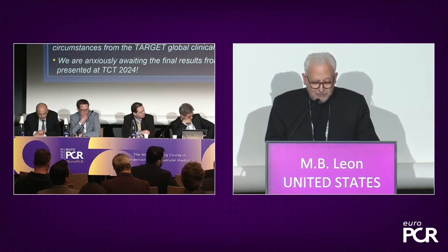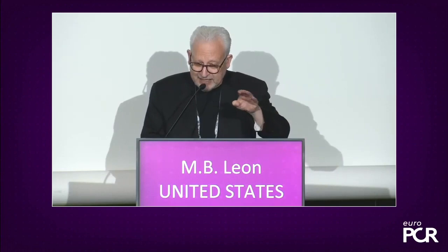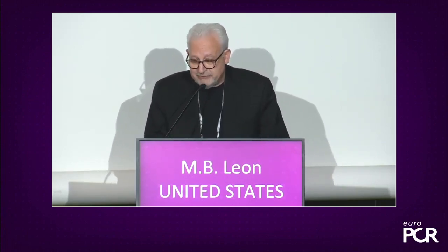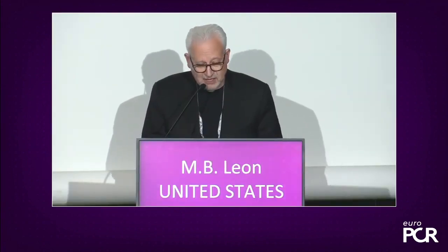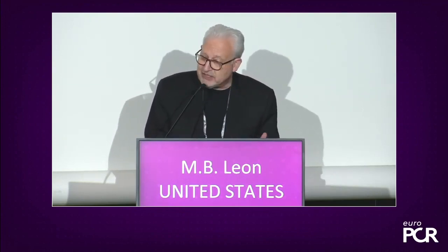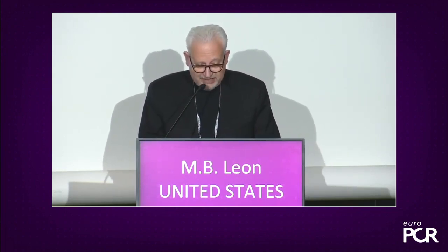So I'm hoping the future will be different in terms of how we do clinical research. With respect to technology, I will say that in drug-eluting stents, we have largely achieved, I think, pretty much a flattening point, a leveling off of the technology advances. This is a thin strut design with a very low dose of sirolimus that has these abluminal grooves that, with a bioresorbable polymer, there isn't that much room, I think, for important evolution of this device. This would be by virtue of characteristics, would be different than anything we have in the United States and would be viewed as a novel device, even though it's been around for, as the better part of a decade.